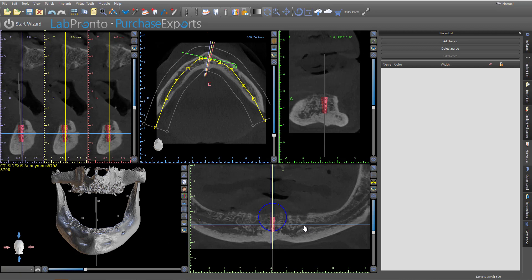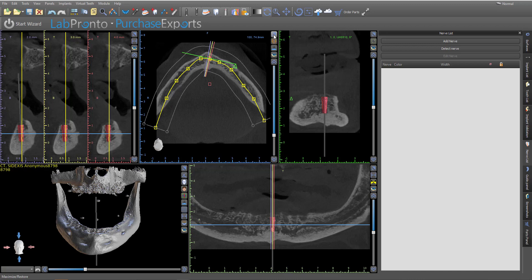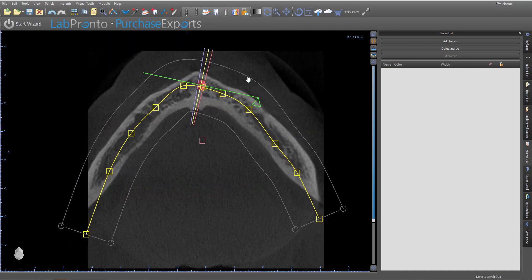Back to the original question — how do we know if this is the mandibular canal ending right here, or if this continues on as an anterior loop or the incisive canal? Again, one indicator is the path it's going to take: it's going to go downward from the mental foramen and continue towards the midline. Second, it won't ever come back. And the easiest way to evaluate that is to look in an axial slice.